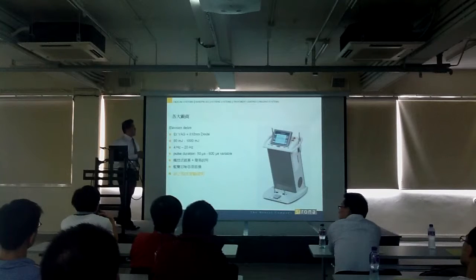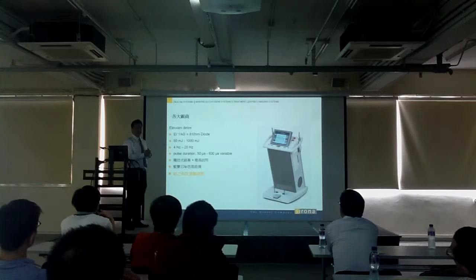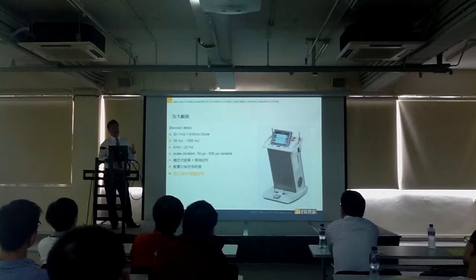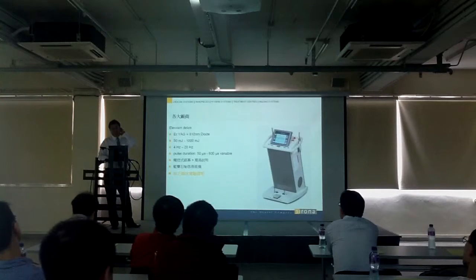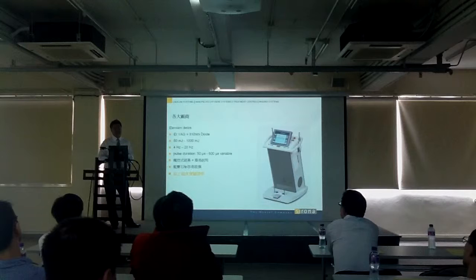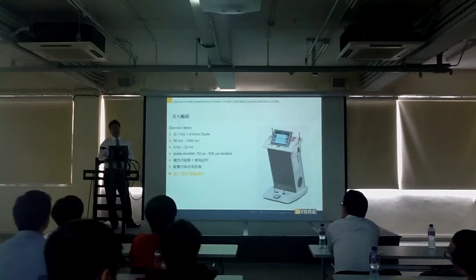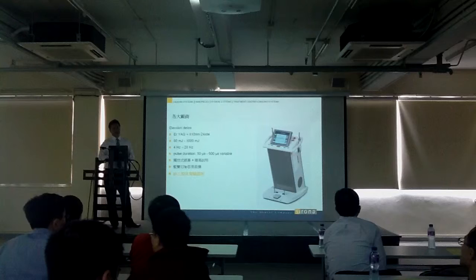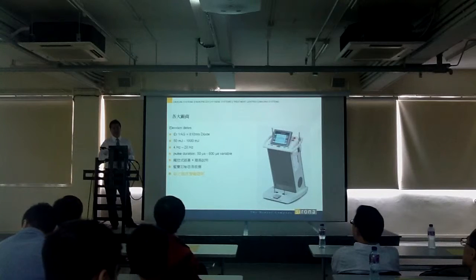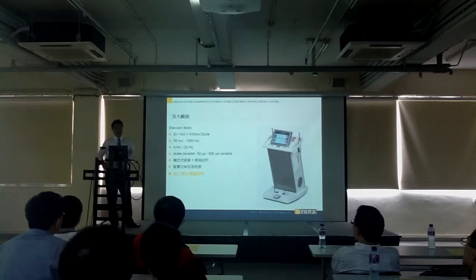But you see, they combine 2 systems in one machine. On the left is Erbium. On the right is diode. It's a more complete way for a clinic. As a dentist, when you start thinking about buying a laser, you have to think what you want to do with the laser first. Then you buy the right one for you. What other people have might not be what you want, because they might do different things than you do. Do you want to work on hard tissue or not with a laser? If not, don't buy everything. Buy a diode. It's enough for you, because the price is a huge difference.